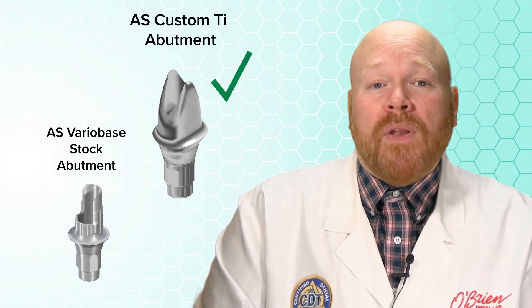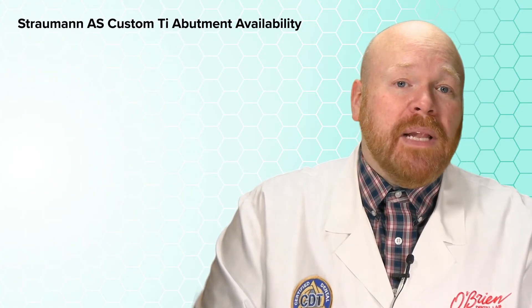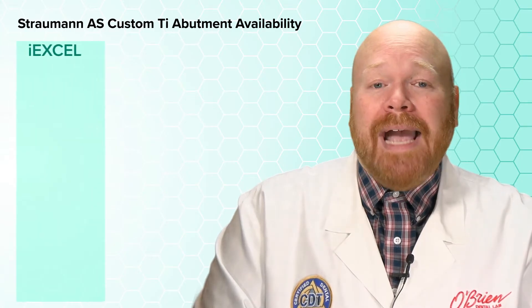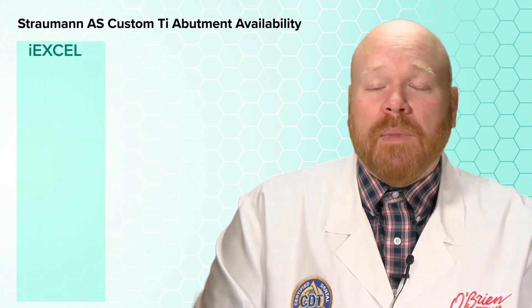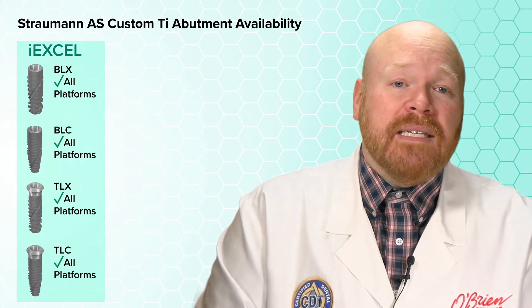A few important things to mention about the custom AS abutments. First, they're available for nearly every Strauman implant currently sold. For the IXL family, they can be made for every platform of the BLX, BLC, TLX, and TLC implants.